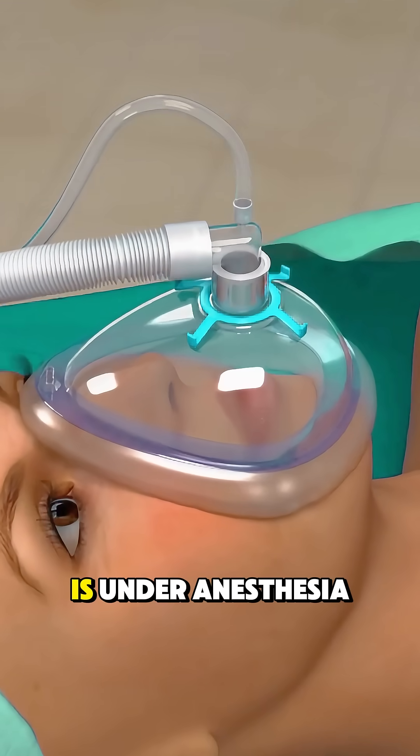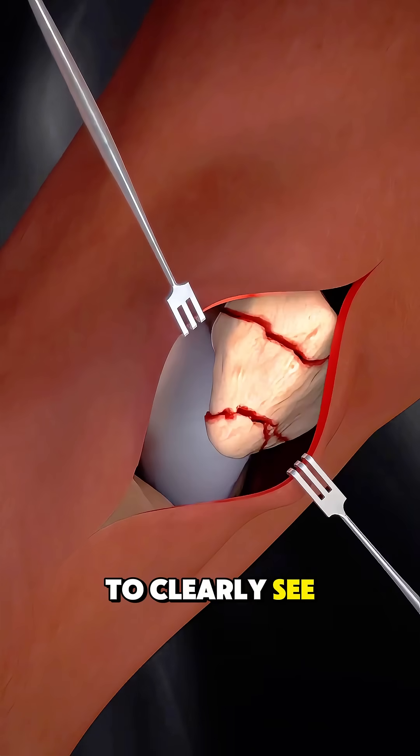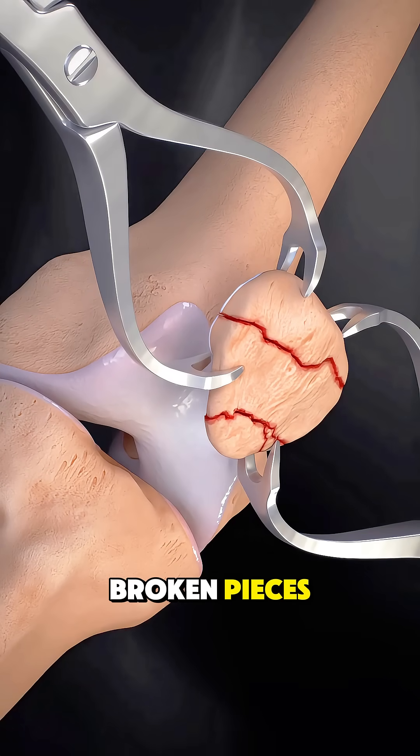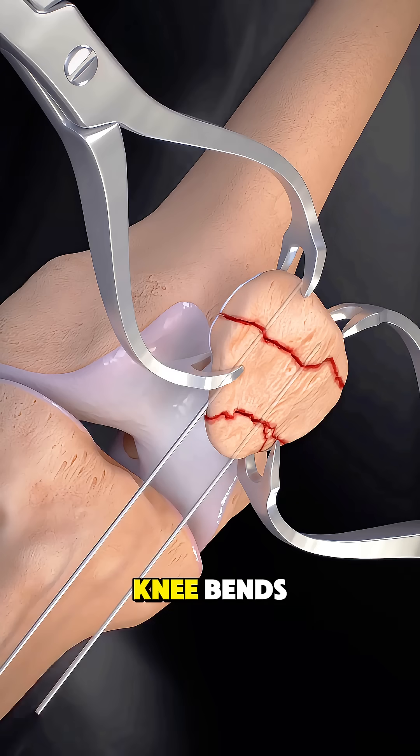After the patient is under anesthesia, the surgeon makes an incision over the knee to clearly see the fractured patella. The goal is to realign the broken pieces so the kneecap goes back to its normal shape and can glide smoothly when the knee bends.